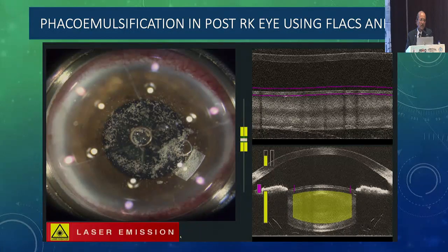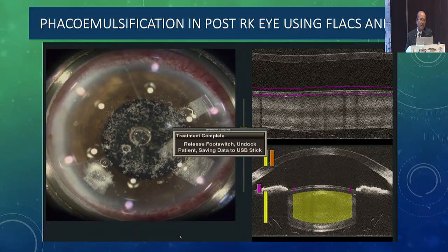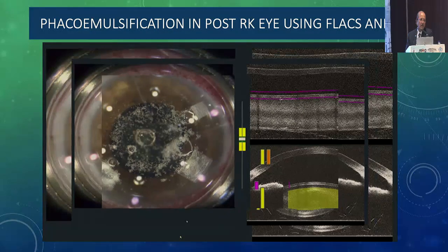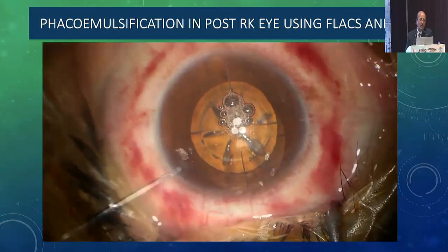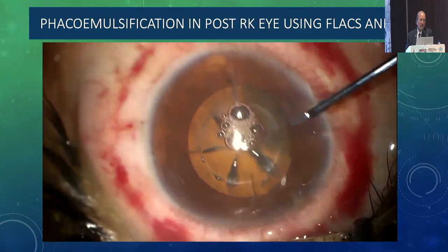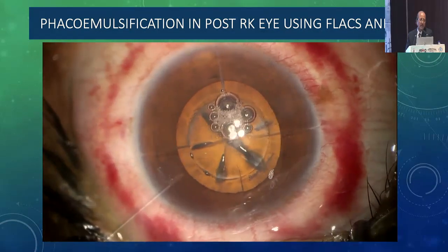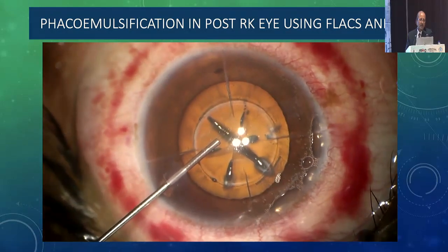This is the side port incision. Main incision and side port incision, then the complete femto part, and then we started with phacoemulsification and removal of the capsule.